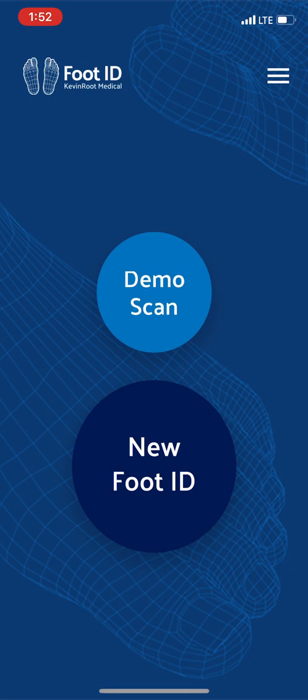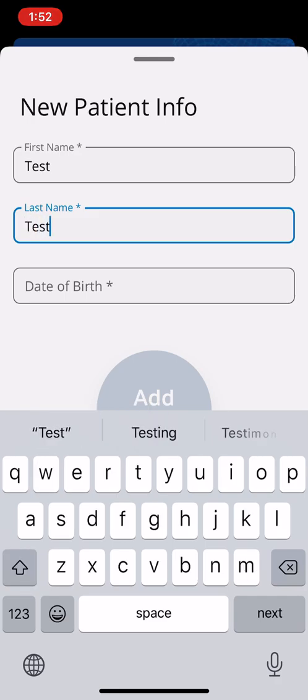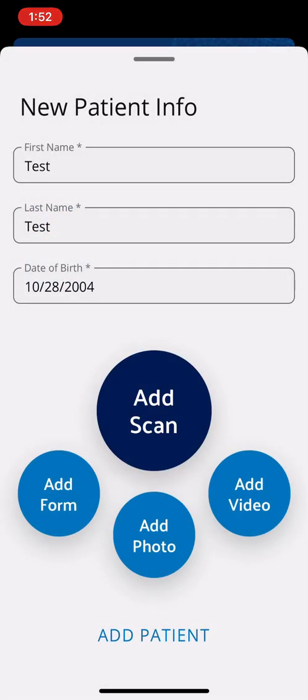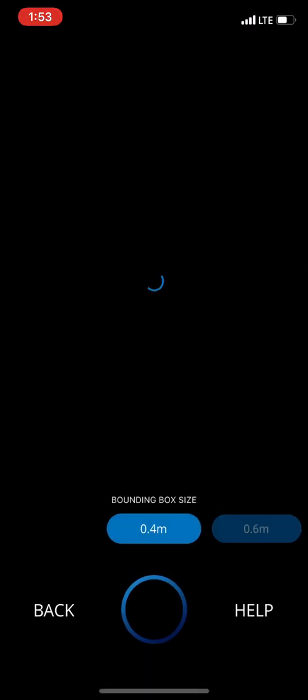Let's go right into a new FootID — this is going to add a patient. I'm going to call this patient 'test, test,' enter a date of birth just to identify the patient, and then tap 'add scan.' You have the type of scan to add, so let's start with the right foot orthoses.